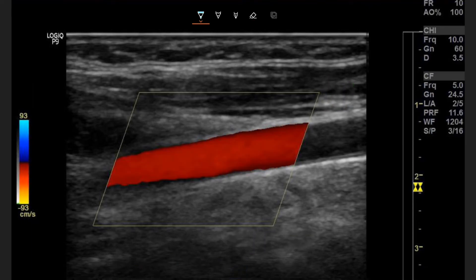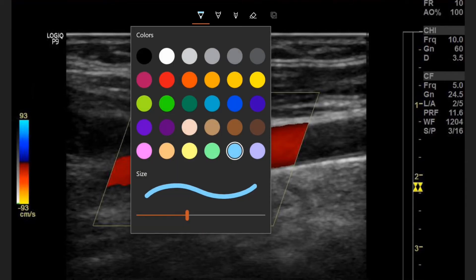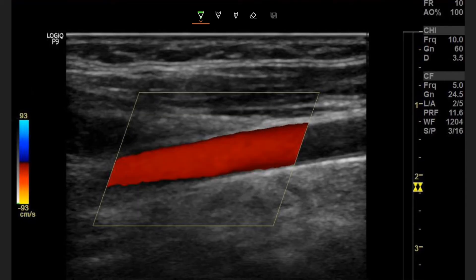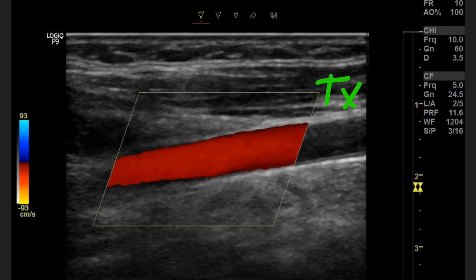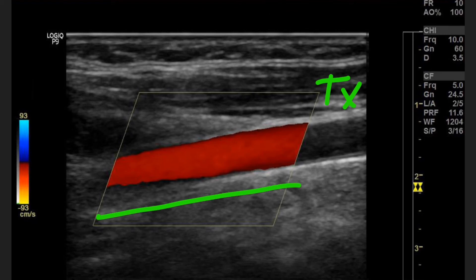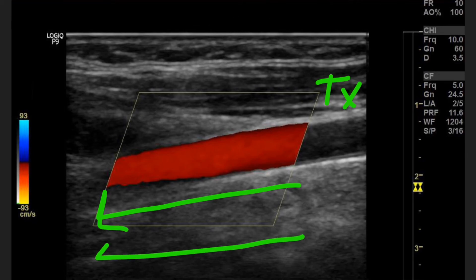Now our color map is flipped, so blue is on the top and red is on the bottom. Blue is going to be coming towards our transducer and red is going to be going away from our transducer. Our transducer location is still over here on the right. We're going away from the transducer now, so the directional flow in this vessel is going to be from right to left.